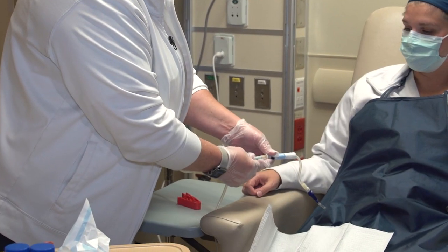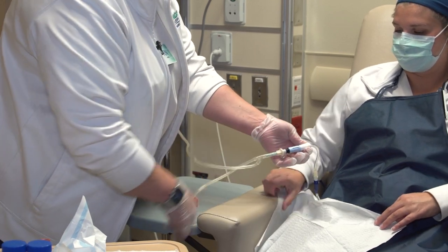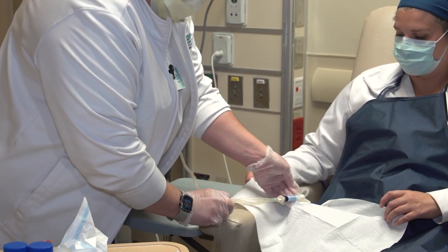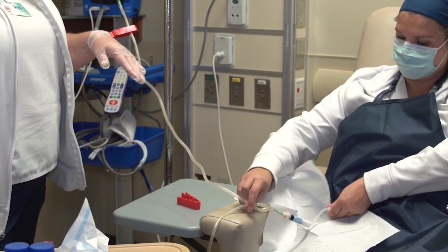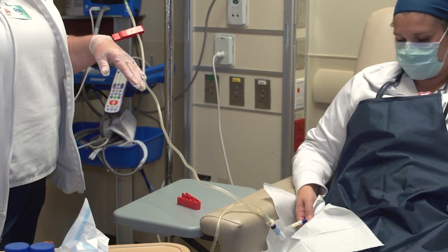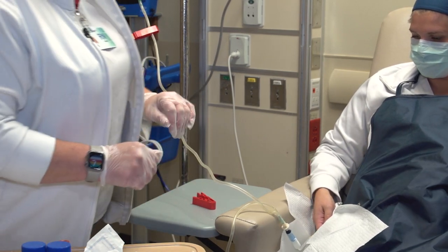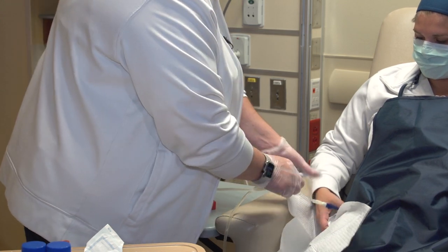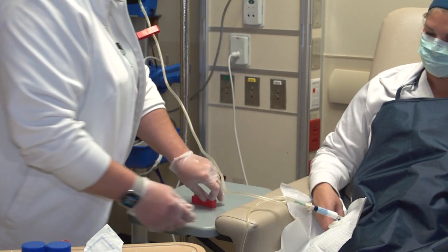I am going to drain first. So we'll open our transfer set. And if the patient has any fluid in, even if it's just a little bit, that will drain out first. This patient came in dry, but we do still try to drain first. She didn't have anything to drain. I'll close the transfer set.